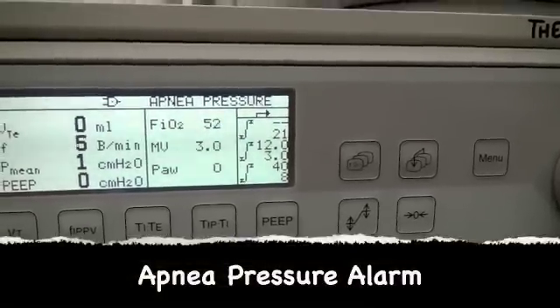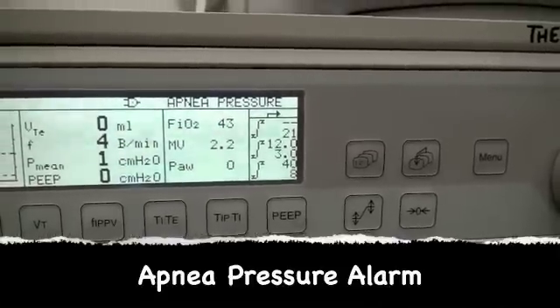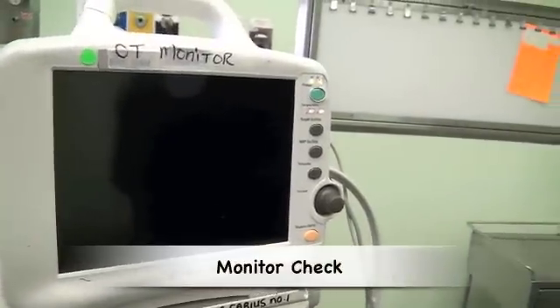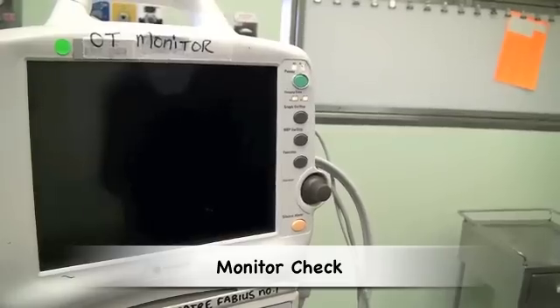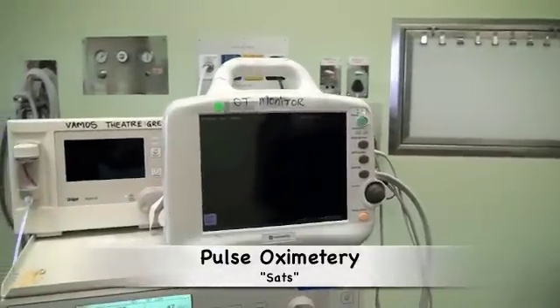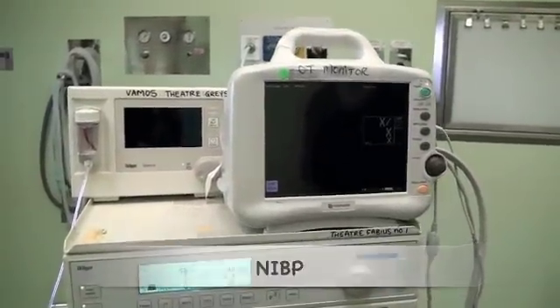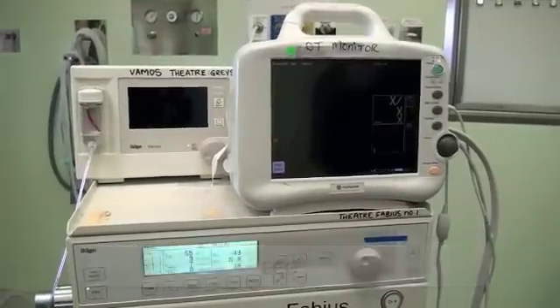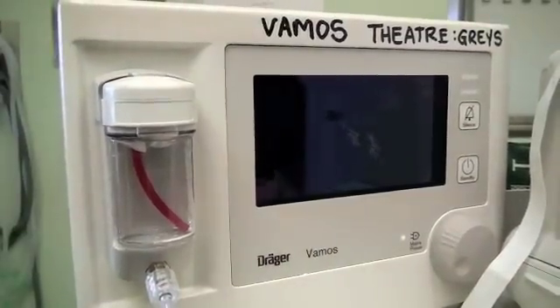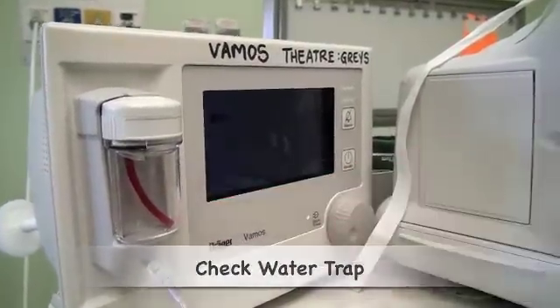Another safety feature is the apnea pressure alarm, which usually indicates a leak within the system. The final part of the machine check is to check that the monitors are working. For most anaesthetics this includes the SpO2 monitor, non-invasive blood pressure monitor, ECG monitor, and capnography. The capnograph has a water trap — check that it is empty. You can check the functioning of the capnograph by blowing into the sample line.